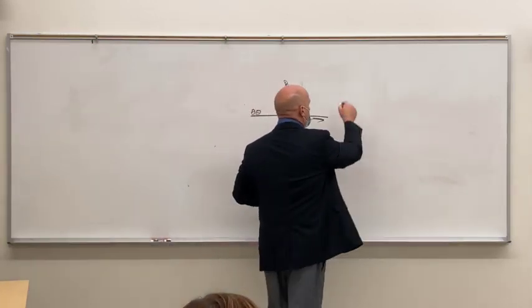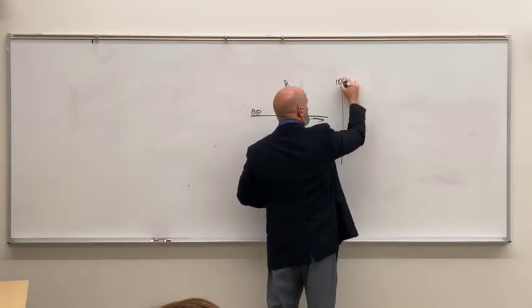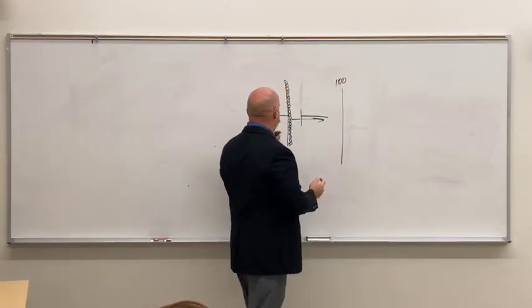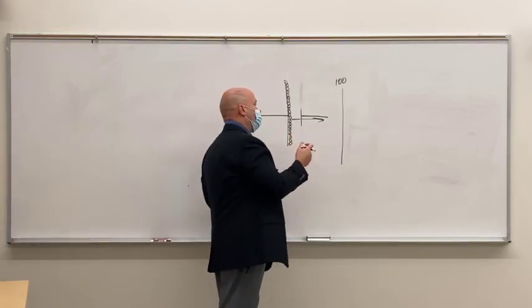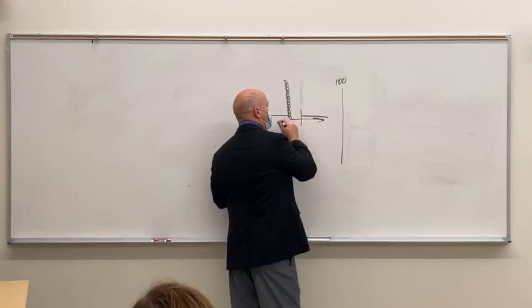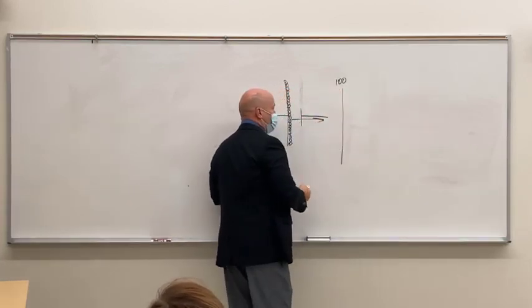And what a capacitor discharge unit does is, you make your exposure, let's say you set 100 kVp, then you store all these electrons, you make your prep, you make your exposure, these things draw closer together, the electrons jump across, and what you get is discharge of the electrons.